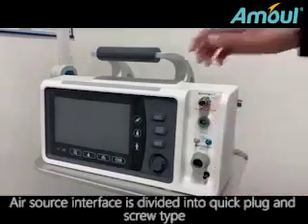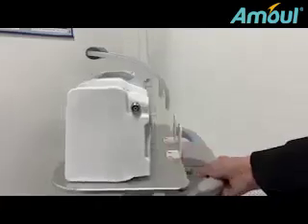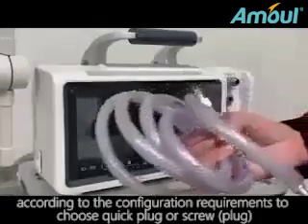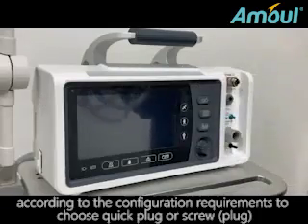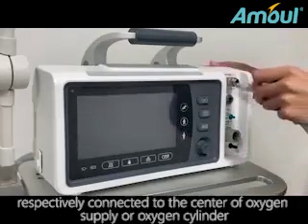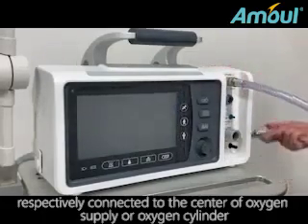The air source interface is divided into quick plug and screw type. According to the configuration requirements, choose quick plug or screw plug, respectively connected to the central oxygen supply or oxygen cylinder.